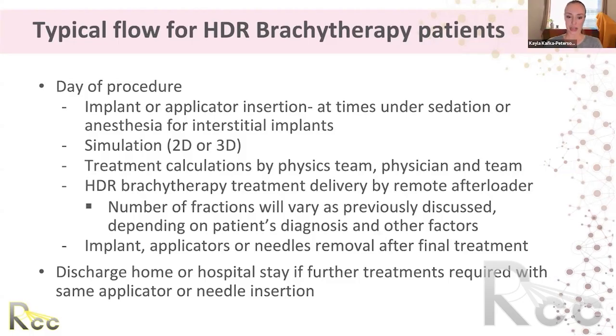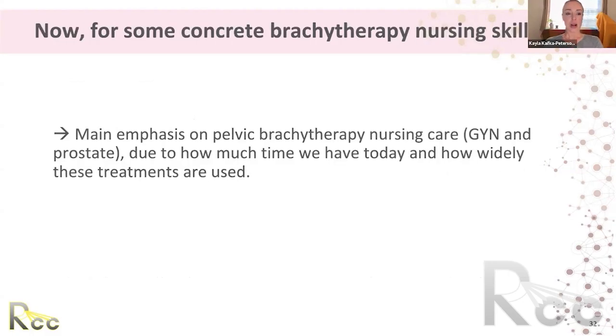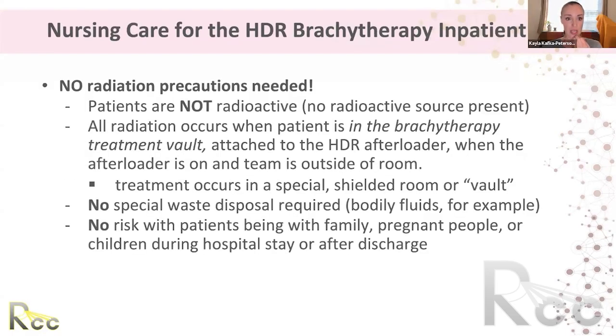So for some concrete brachytherapy nursing skills, again, I've emphasized this will be mostly for GYN and some prostate, just due to how much time we have today and how vast these treatments are. Most important thing for HDR brachytherapy, no radiation precautions are needed. These patients are not radioactive after their treatment. And this is something that a lot of people are very afraid, to be around our patients, because they don't know if they're radioactive or not.